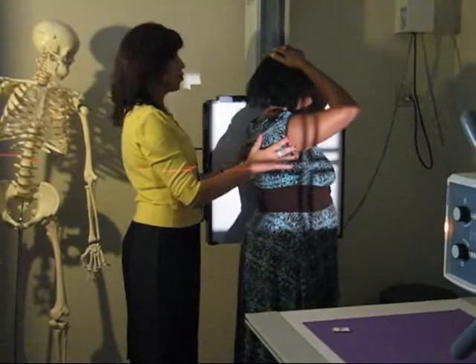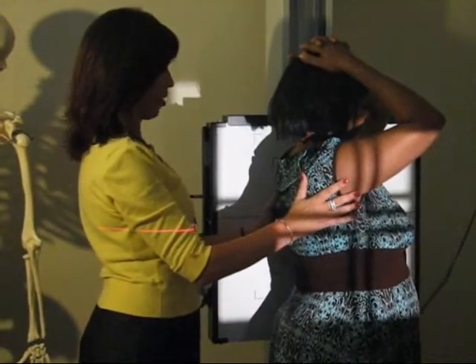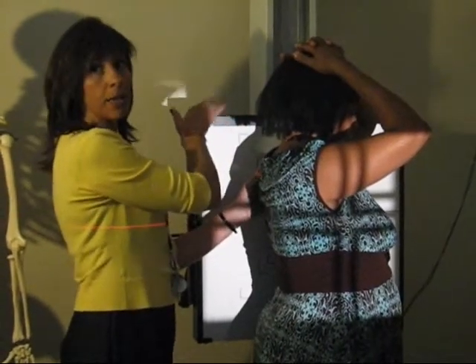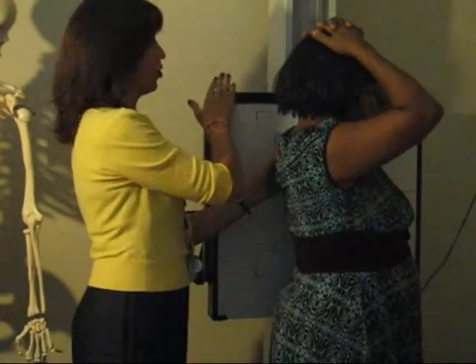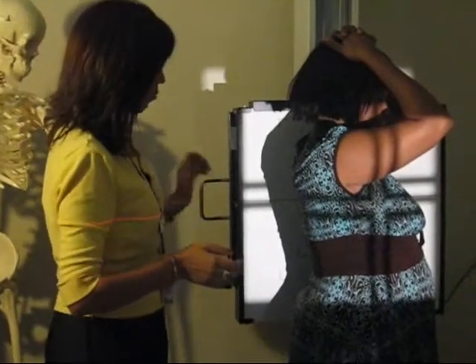Okay? Have them come close to the IR and still stand straight though. A lot of patients will have a tendency to kind of lean. You don't want that because you don't want any distortions, okay? If you already did the PA projection of this patient, the alignment of the cassette shouldn't change from the PA to the lateral position, okay? So now everything is lined up, our cassette and our central ray.